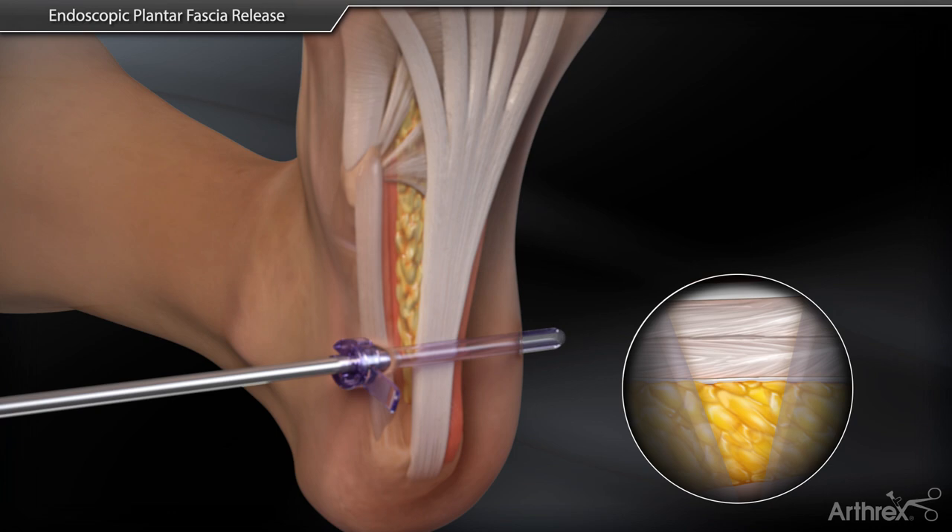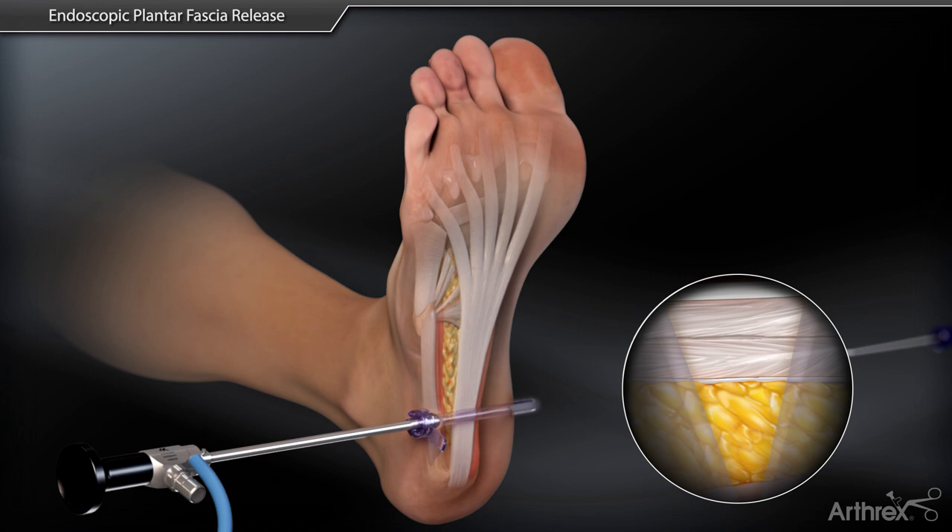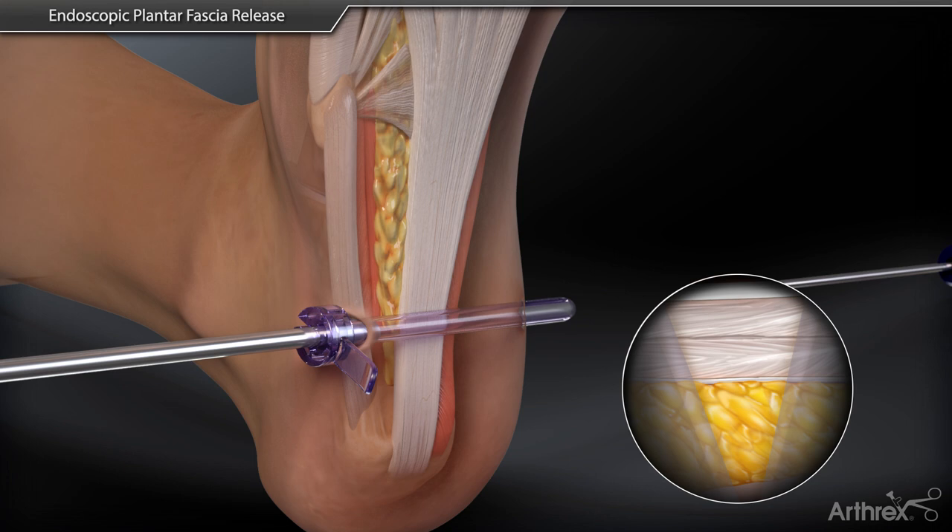At this point, the toes are manually extended, creating fascial tension. If any fatty tissue remains obstructing the view of the fascia, a rasp may be inserted to improve visualization.